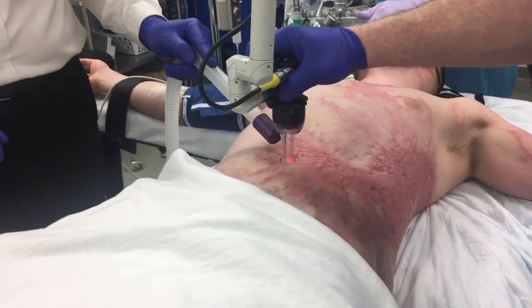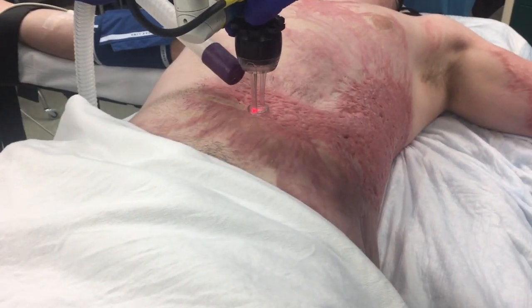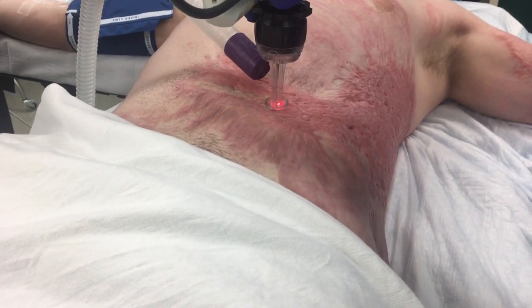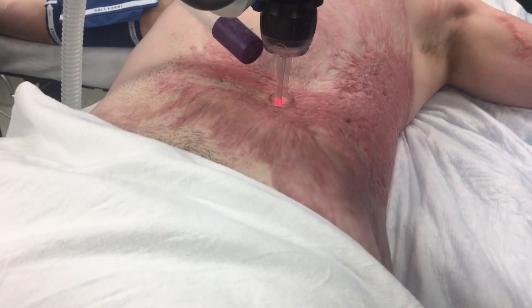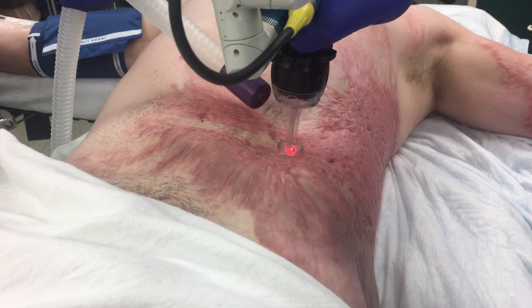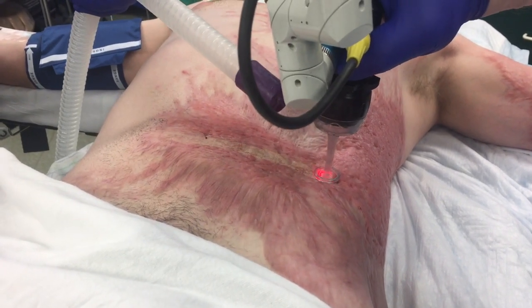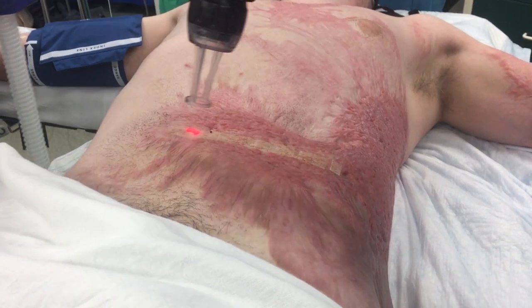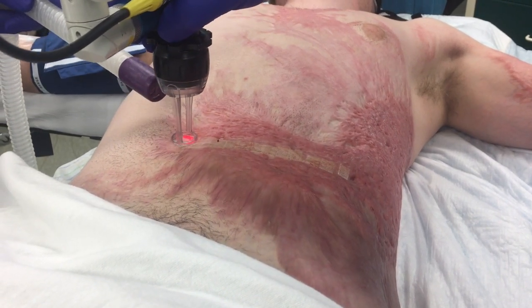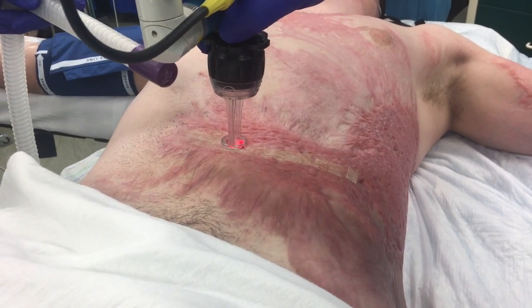As we move across the skin grafted area that's designated by the hatch marks, you can see that the laser device is creating multiple randomly generated penetrating spots that are clearly visible and make the technical elements of the reconstruction that much easier.